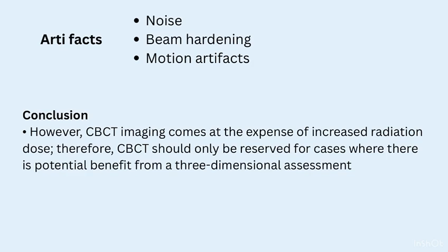So, to conclude, CBCT imaging comes at the expense of increased radiation dose. Therefore, it should be only reserved for cases where there is potential benefit from a three-dimensional assessment.